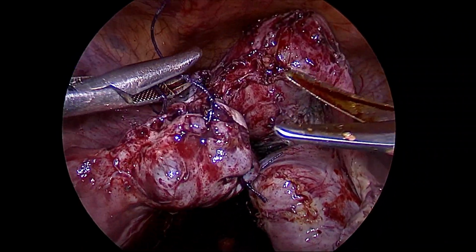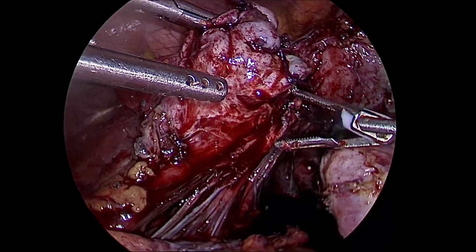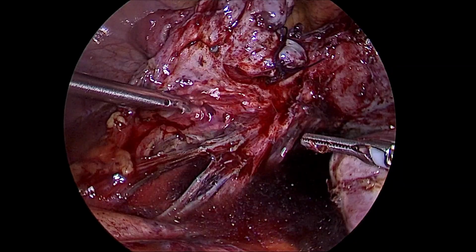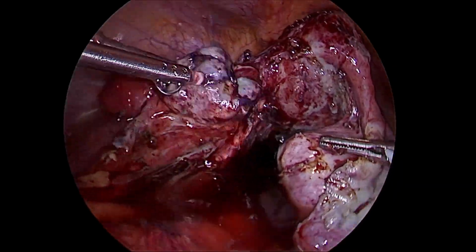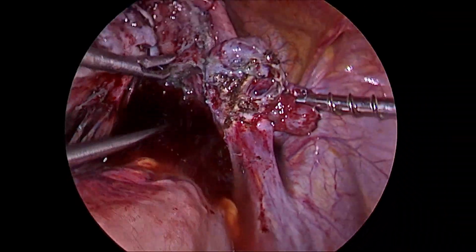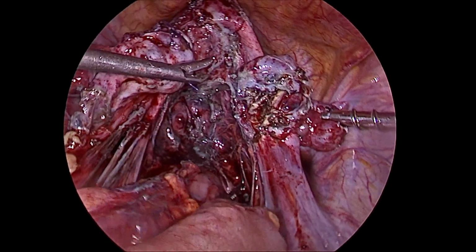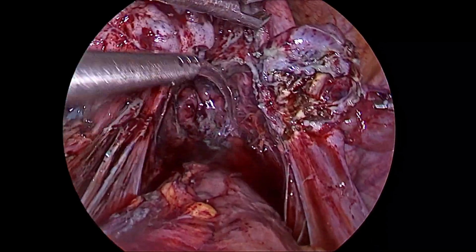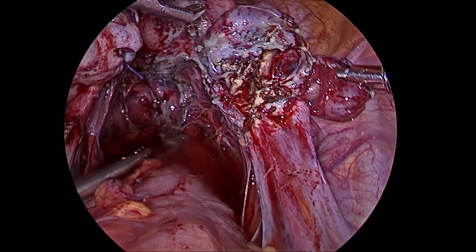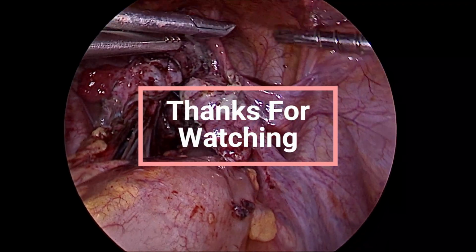There we just cut the sutures, and after that I have a habit of giving a good saline irrigation. I use up to 1 to 2 liters of saline. I like to get all the blood clots out of the pelvis, and what we have found is that once we do this, the post-operative analgesic requirement reduces, post-operative pain is much lesser, and of course when we've done C-sections on these girls, the POD is almost clean. There after a good wash you can see there is hardly any bleeding. The total blood loss in this surgery was hardly any 10 ml.